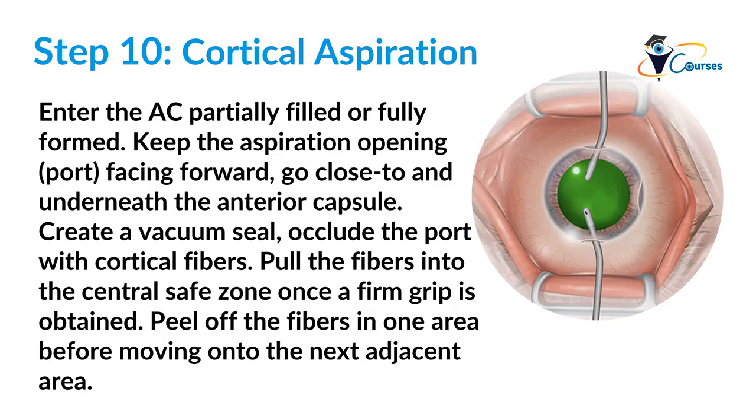So for me, if you are asking my technique, the best and safe thing is to do supracapsular phaco. The nucleus is soft, it will not harm the endothelium, and also you will be away from the posterior capsule, if you are afraid of holding the nucleus near the posterior capsule and hitting it by chance. So the best is to do very good hydrodissection, trying to get the nucleus into the anterior chamber.